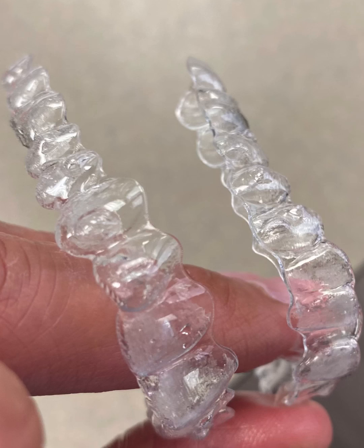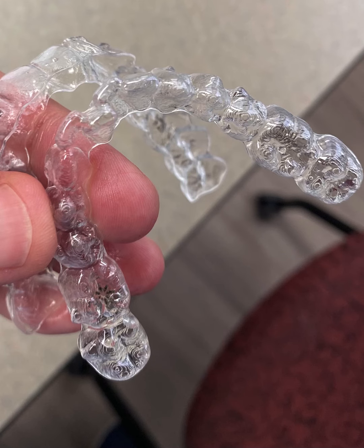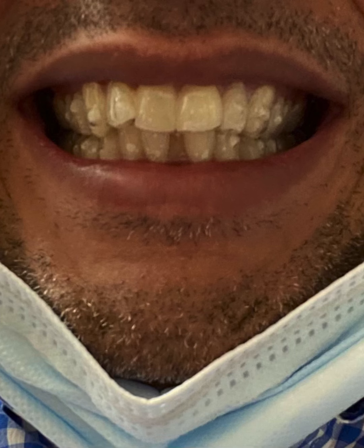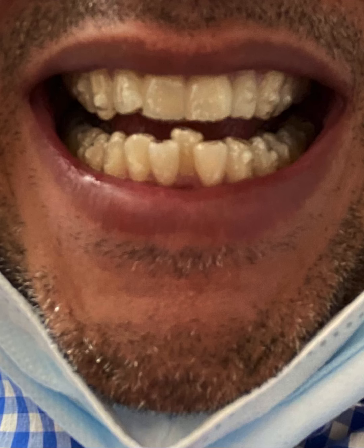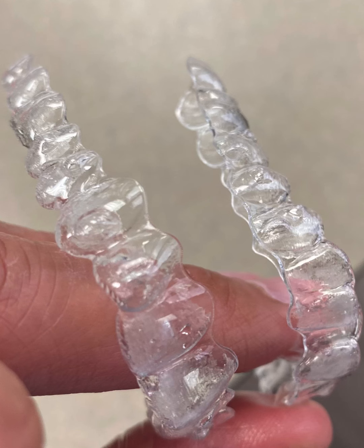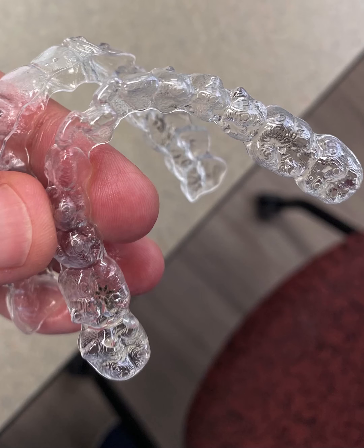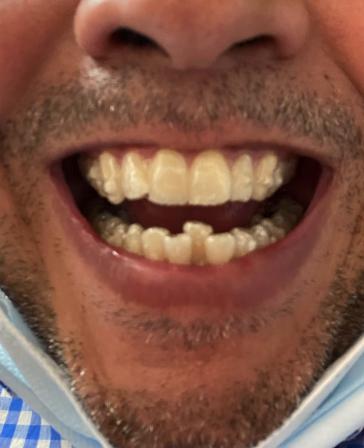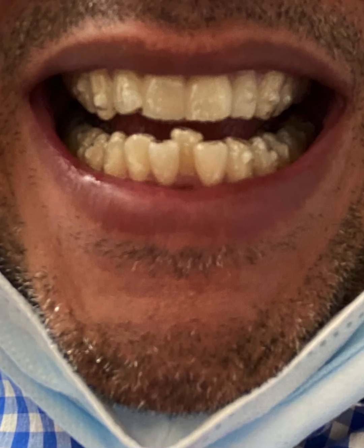Number two — this is one I learned along the way — is your nails. When you're cutting your nails, don't cut them too low because then it's hard to take your trays out. That was one I had to learn the hard way. I cut my nails really low and then the next day I could hardly get them out, and when I did get them out it was pretty painful on my fingers. So that's a good one to keep in mind.